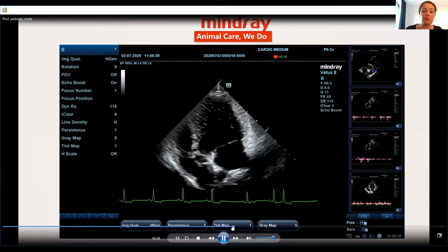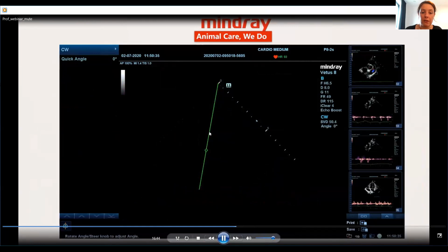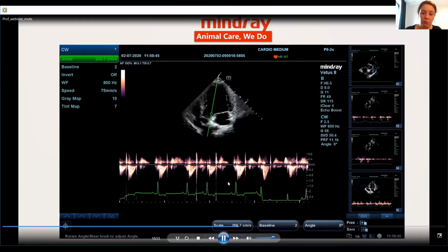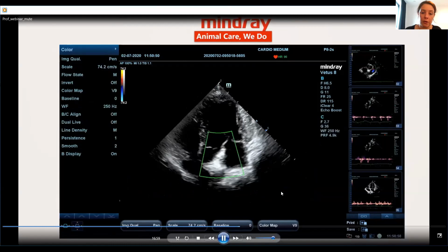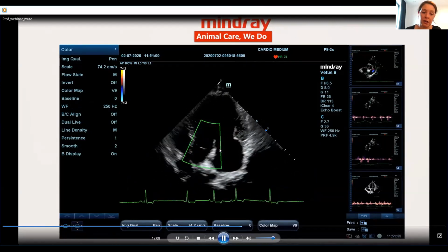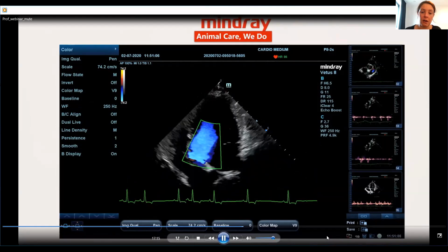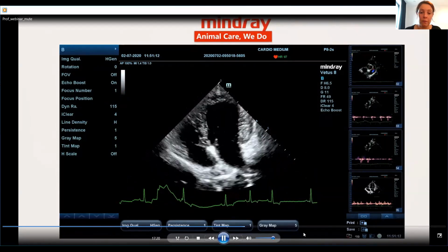Yeah, so now we are moving on to the left apical 5-chamber view. We have our aorta here, and this is again the continuous wave Doppler. And what I'm doing is I'm putting the continuous wave Doppler in the aorta. When your dog is moving, you can move from your 2D image to your color Doppler, to your continuous wave Doppler image to correct the angle of your cursor. This is then the color Doppler on the aortic valve. So we don't actually see significant insufficiencies or turbulent flow. We also didn't expect it because the dog has no heart murmur.